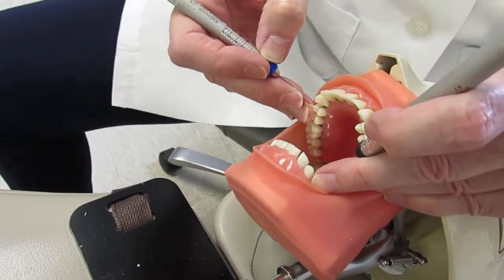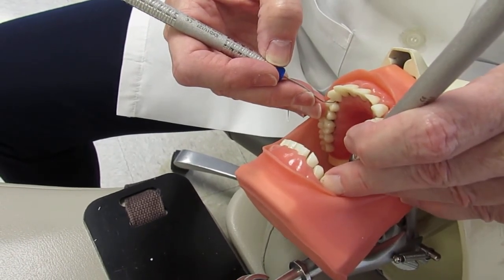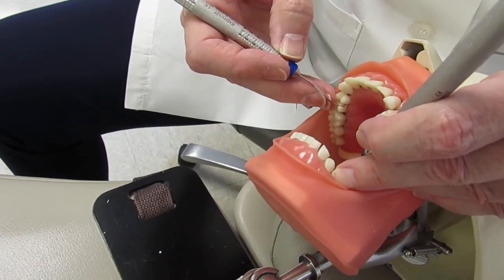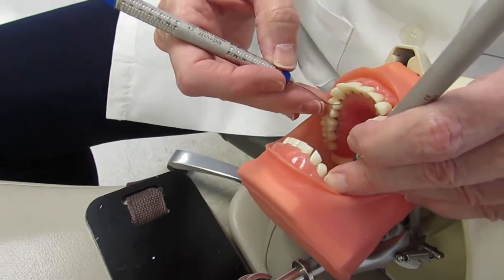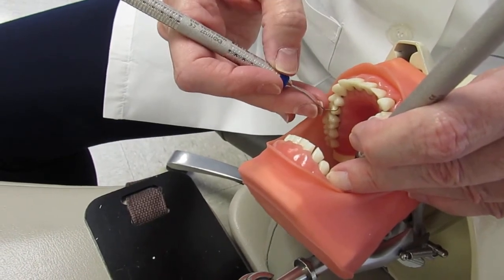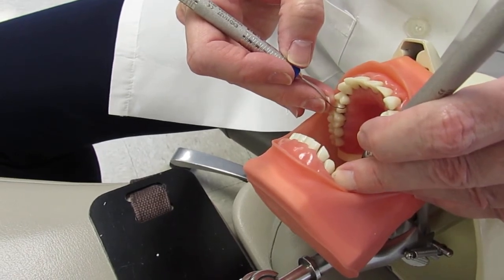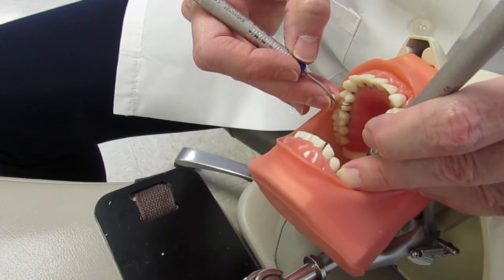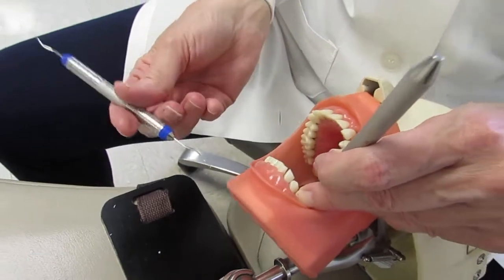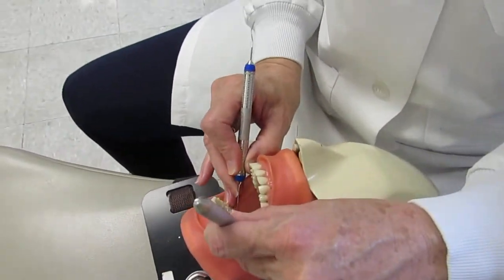From the 10 to 11 o'clock position with the maxillary right linguals done, move to the mandibular posterior right sextant. Rather than change position, apply the opposite rule: on the maxillary posterior sextant the surface was away, and on the mandibular right sextant the surface is still away — only one opposite (maxillary to mandibular). One opposite means flip the working end. Flip it, and you're good to go for this sextant.